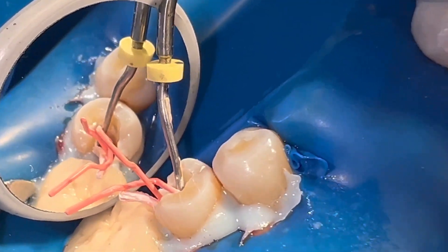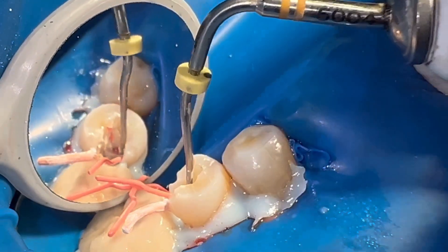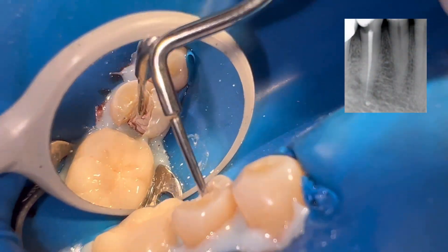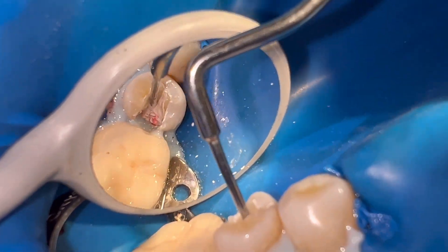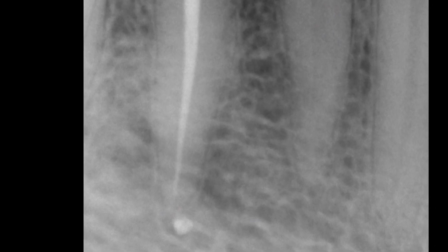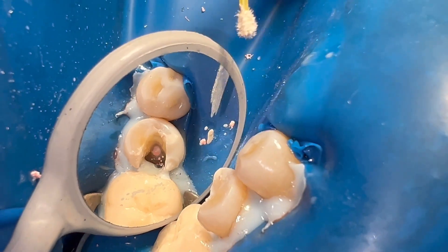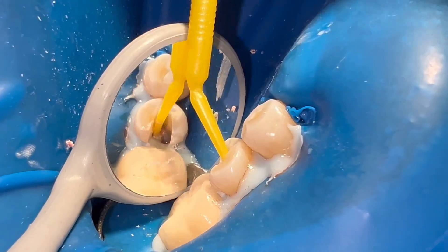The gutta-percha aperture is cut at the beginning of the canal and compacted with pluggers. In this case I use a bioceramic cement. We then use an endo Z burr and micro brush soaked in water.